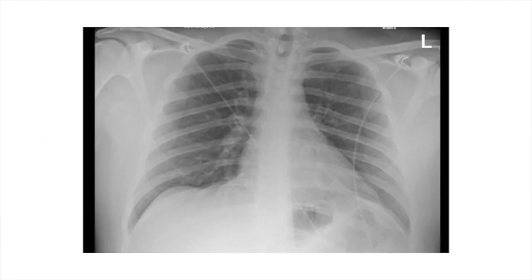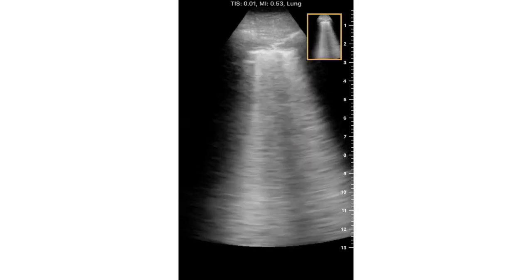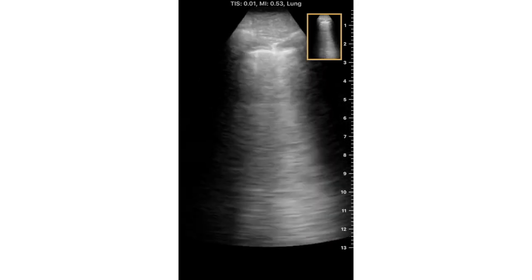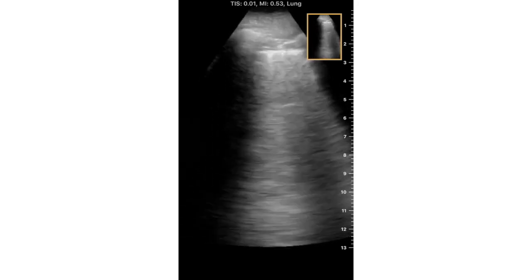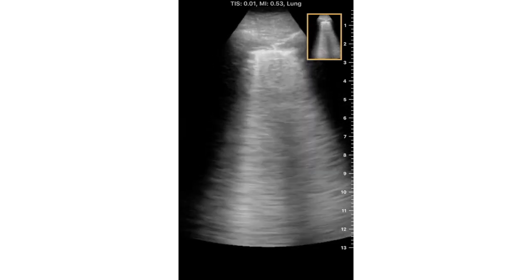Now, this is a very interesting thing that we're seeing, and I know that people have been reporting these. These are patients who have been referred for other reasons, but they are well in themselves. They have no symptoms of COVID, have a normal chest x-ray, but have an abnormal scan. And this is worrying. So this is a normal chest x-ray of the patient, but this was his scan at the bases. Look at that thickened pleural line and the B lines. Patient was very well, not spiking, not lymphopenic. So are these the asymptomatic carriers that are around in the community who are well, but spreading to the more vulnerable? So this is quite interesting phenomena that we have seen.